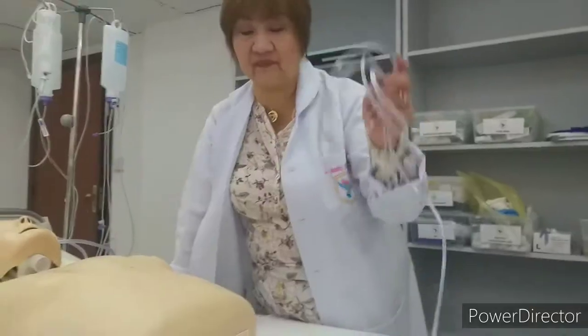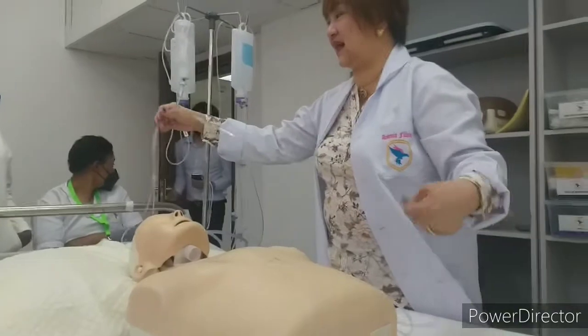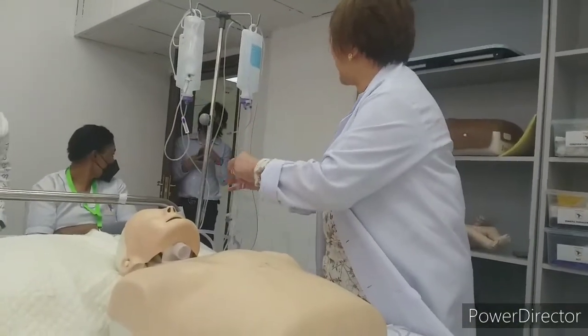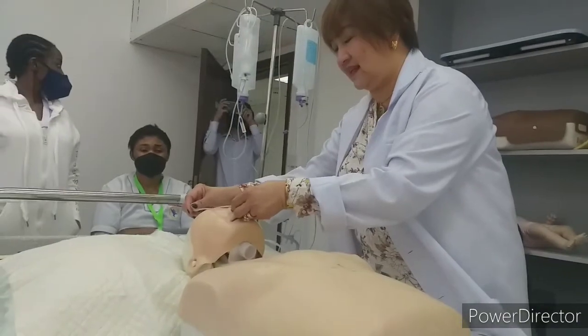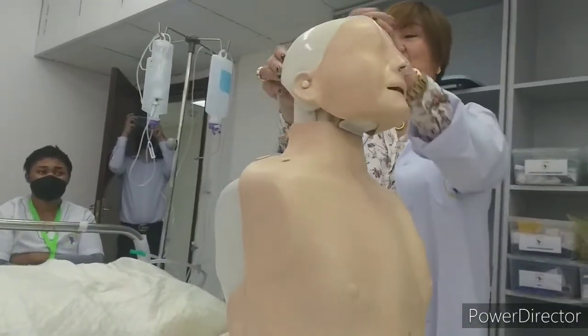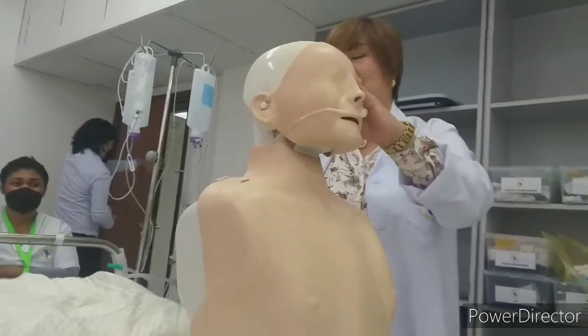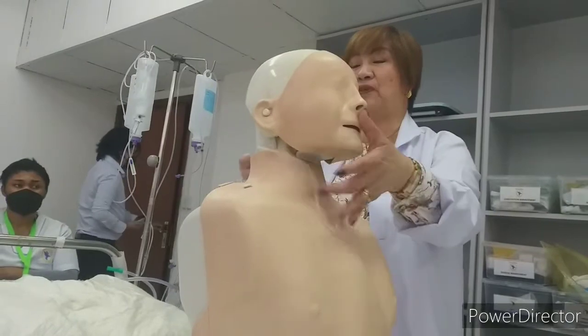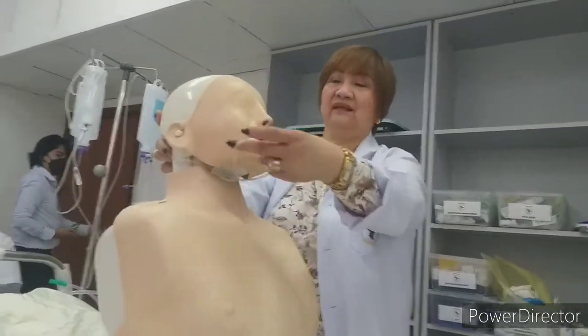Question. I like to answer question. Attached behind because maybe the patient is lying on it, we might obstruct the flow of oxygen. No, it will not. Why? Why not? It's not going to choke because you are not going to put it down here. Nobody will choke from the back. The choking is from in front.